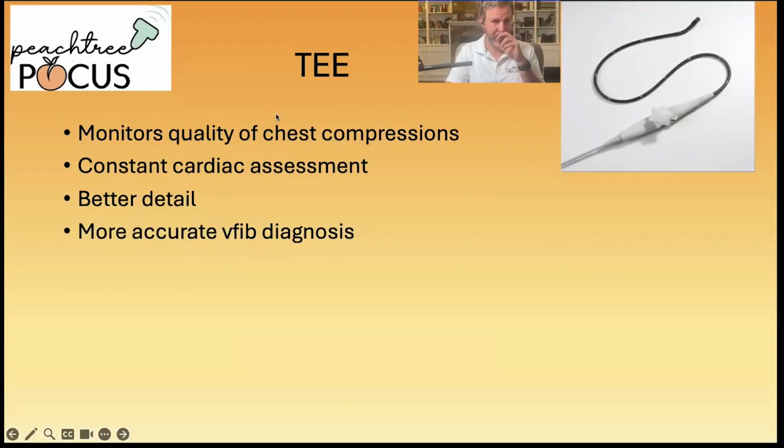So some emergency departments and ICUs are actively using it during cardiac arrest, and where it's available in the OR, you're going to use it in the OR in cardiac arrest. But I think we'll see it spreading more widely over time. So why is TEE so awesome and powerful when it comes to cardiac arrest? Firstly, it lets you monitor the quality of the compressions.